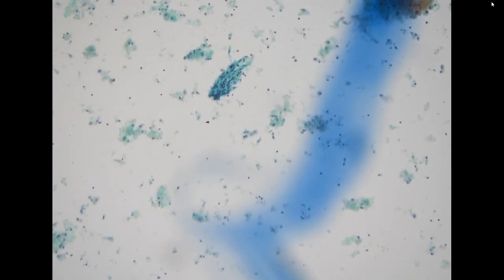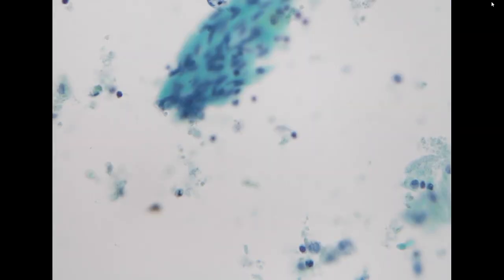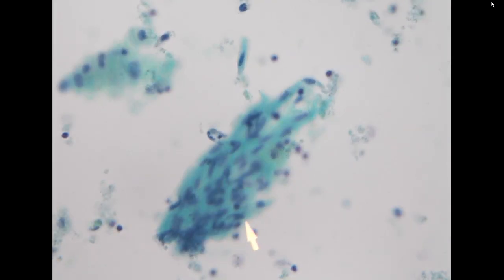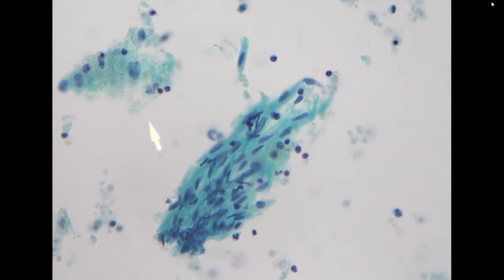There is only one tiny cluster of spindle cells, and it has a little bit of squamous feature. So these could be squamous epithelium. This is not very common, but in this scenario, it could be, for example, just a lymphoepithelial cyst, inclusion cyst, simple cyst, or it could be a metaplastic tumor with cystic change and squamous metaplasia.